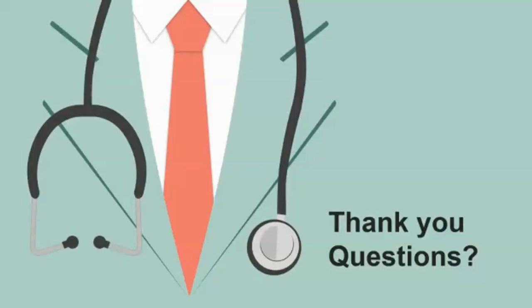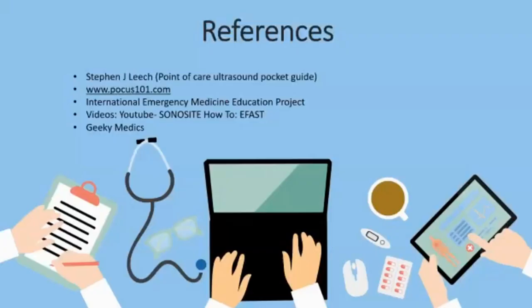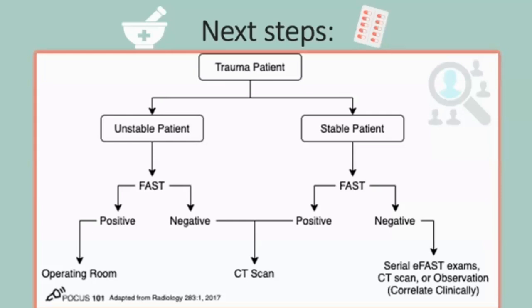Okay. Can I ask you to go back to that slide with the algorithm of how to investigate patients? This one? Yes, but with the, so press your space bar or your slide again once stabilized. That's a very important point, because if your unstable patient has got a negative EFAST, we need to find out why the patient is unstable, stabilize them first, and only then can we take them to the donut of death. Yeah. Cool. Any other questions, any other comments from anybody else?